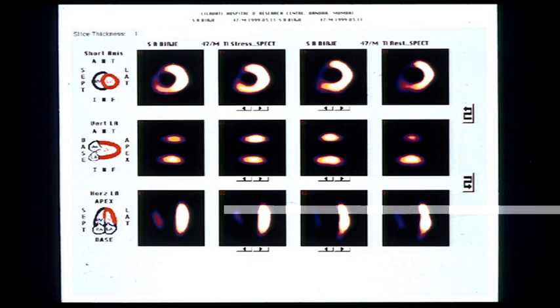So this is a slide which I am showing you. This is a slide where angioplasty has been done, and you are seeing a fixed perfusion defect here in the anteroseptal wall, in the stress and the rest image. So what benefit did the patient get? Nothing. The angioplasty has been done and the patient is having shortness of breath and is symptomatic, so what benefit have we given to the patient? Unfortunately this patient was not subjected to a stress myocardial perfusion scan.